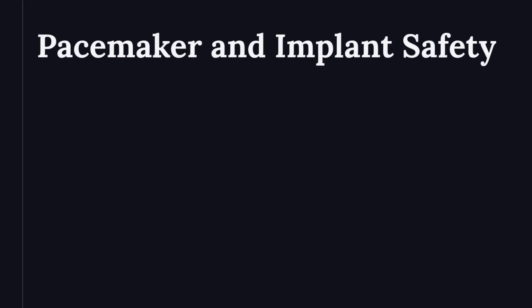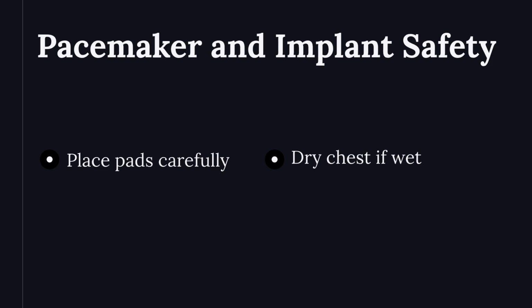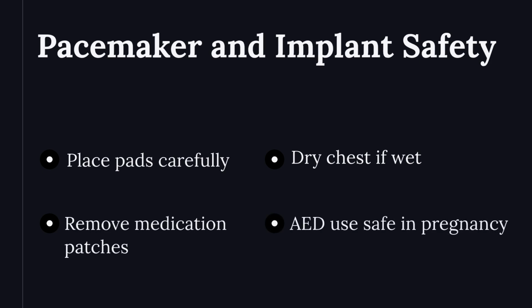Be aware of pacemakers or implants. Place pads at least 2.5 centimeters away. Dry the chest if wet and remove medication patches. AED use is safe during pregnancy. Always follow the device's instructions.